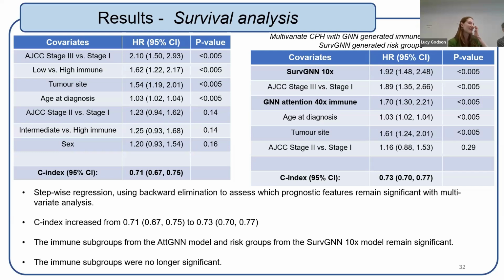So that's the next step, I think, to test it on an independent data set. Especially because in the TCGA we've got primaries from primary melanoma, so it'd be good to test on that. When you say it didn't perform better than the existing staging, you mean in terms of hazard ratio? And C-index. What was the C-index? So it was 0.71, and then with the new features, 0.73.